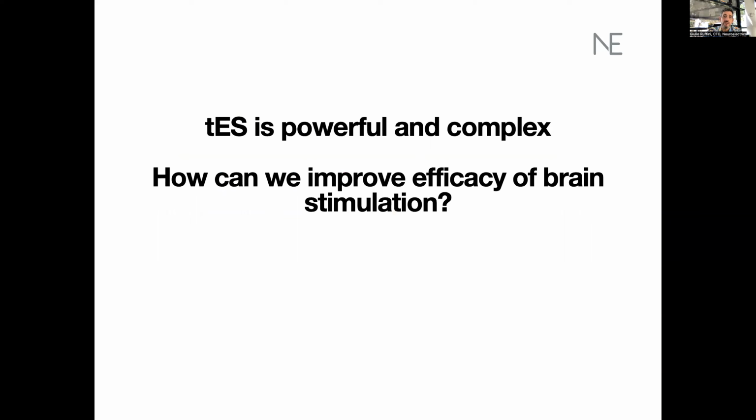So the question ahead of us is, it's a powerful technique, and we have developed, at Neuroelectrics and other places, devices that can deliver multifocal stimulation, applying currents in multiple places in the brain and with multiple waveforms. And the question is, how can we use this? How can we improve the efficacy of the application? As usual, with my physicist background, I will tell you that you need a good model of reality in order to improve your models and control things better.